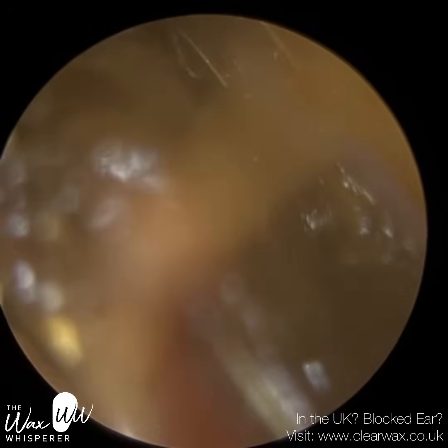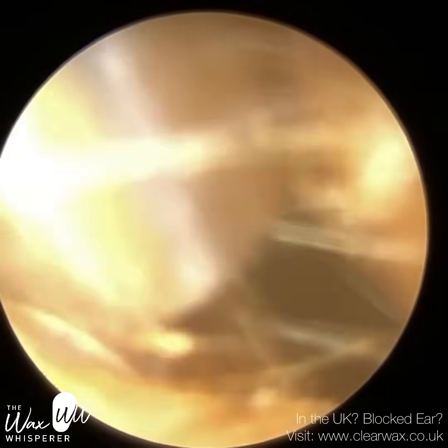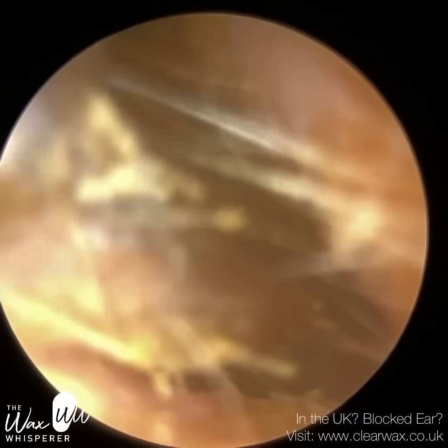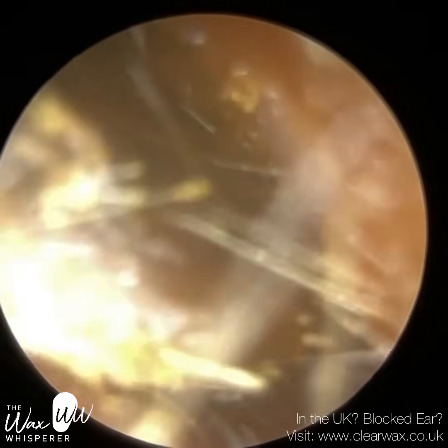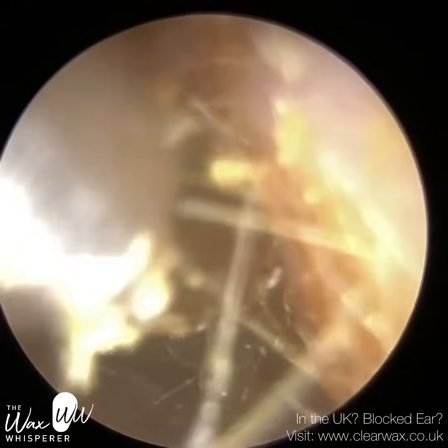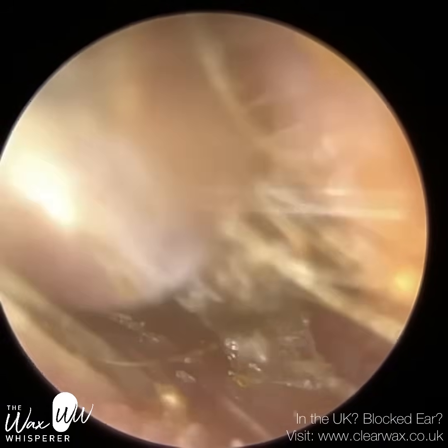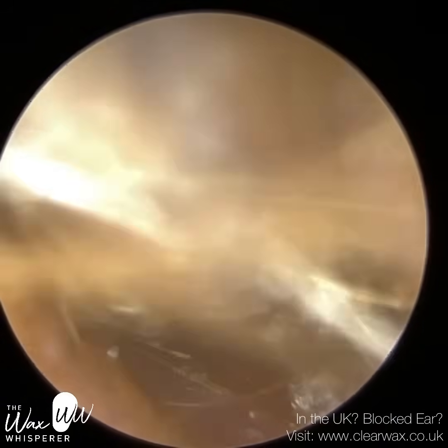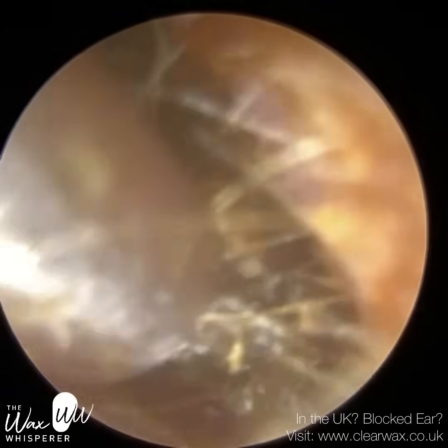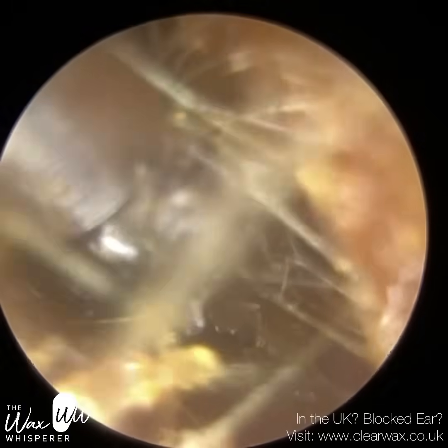Similar to the right side, it's a very narrow entrance. I'm just using the endoscope to stretch the ear wide open. Because we're having to use the endoscope to stretch the ear open, that's why the view of the wax is quite close to the endoscope — the endoscope is not only being used to visualise the wax, but it's also being used as an instrument to stretch, widen, and dilate the ear canal so we can insert the suction probe and remove the wax. You can see there's very little room for manoeuvre. The wax is quite dry — I believe I'm going to use some olive oil spray again in a moment.